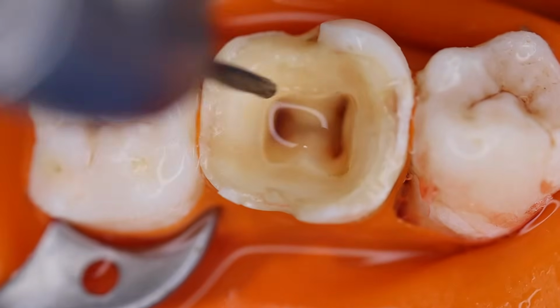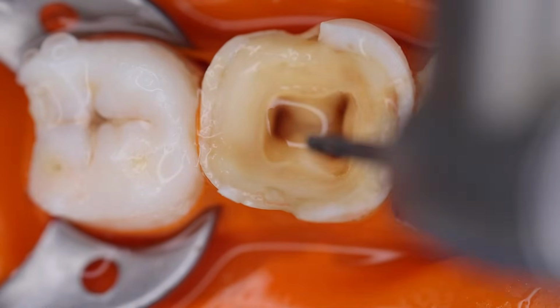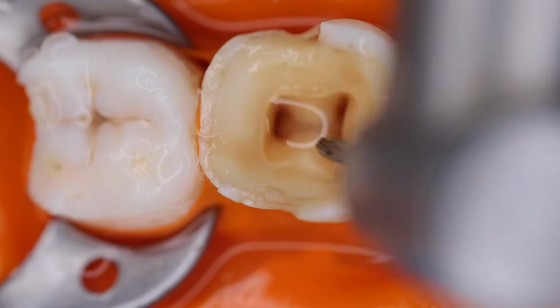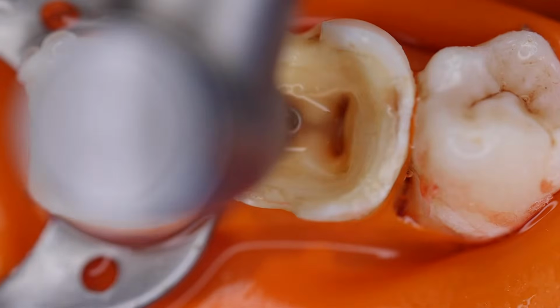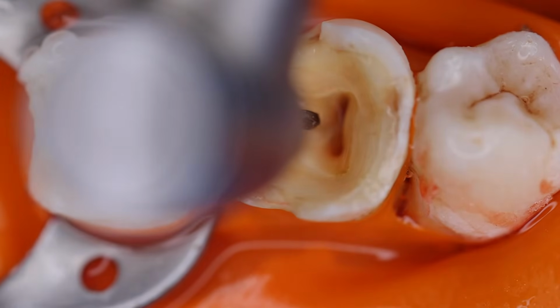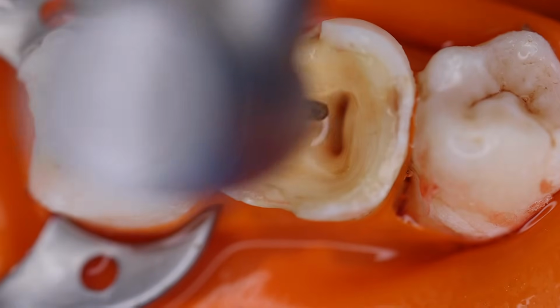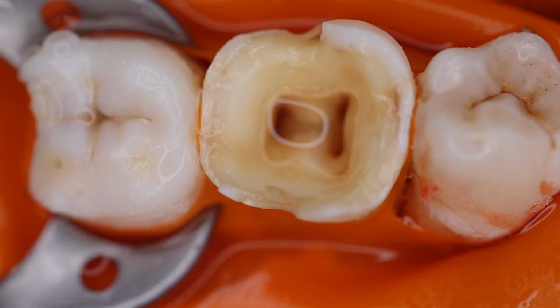Hope you get my point, doctor, that the digging that you were talking about is once you are opening or going inside in the central area or at the centralmost point, you would feel the burr go freely inside in one go at one particular point. That is, you have entered into the pulpal chamber from the roof of the pulp chamber. So this was the point. Hope I was able to clear it.